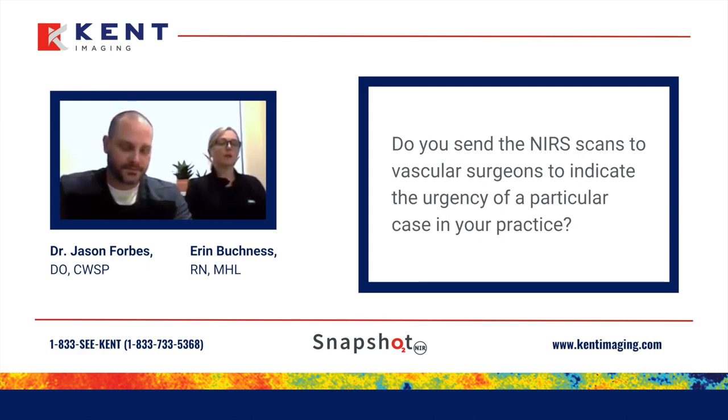Amen. I wish I had a percentage, but say we send 5 patients to vascular a month, I would say about four of those 5 patients are receiving some kind of intervention or have a history of needing an intervention and need further vascular surgeries or what have you. So really that time, like Dr. Forbes touched on, that time wasted is not there, because we already have that data, that proof showing, okay, this patient probably will need further workup, arterial Doppler and possibly the OR time.